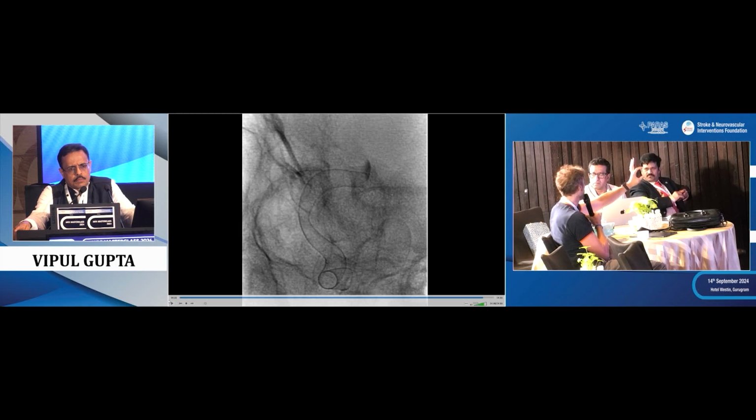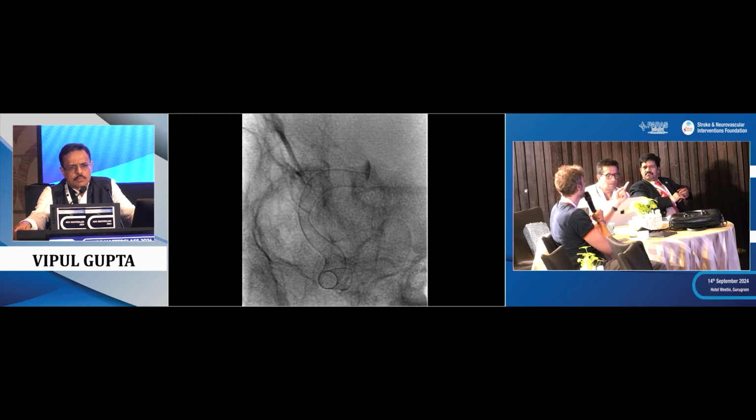If you have a very short anchorage in distality and a large diameter in the aneurysm, then the modification of the diameter of the aneurysm matters, because the flow diverter is just one piece. The braid at the end is the same as the beginning. So each time you do something at one part, you're modifying a little bit the rest of the structure. So if you do not have an anchoring that is important enough, then you are pushing on the stent, and you are fish mouthing the distality.